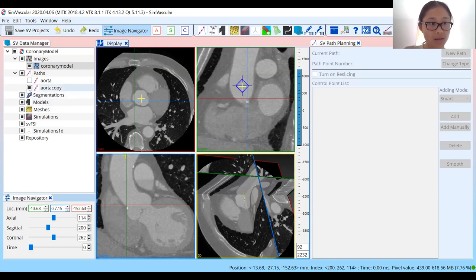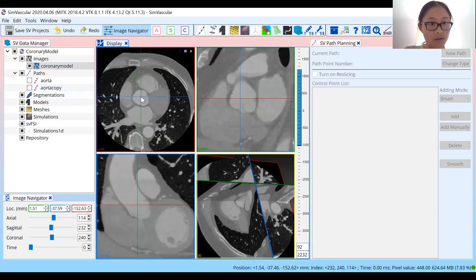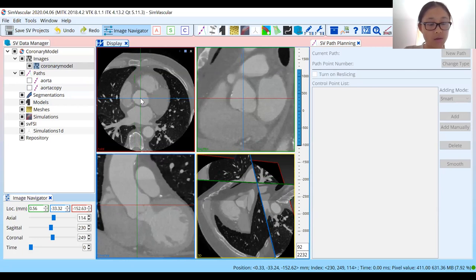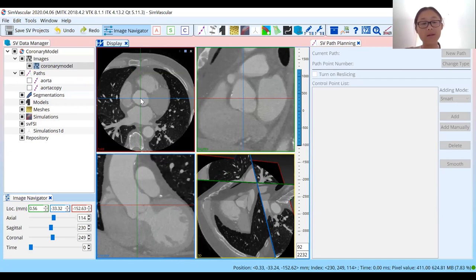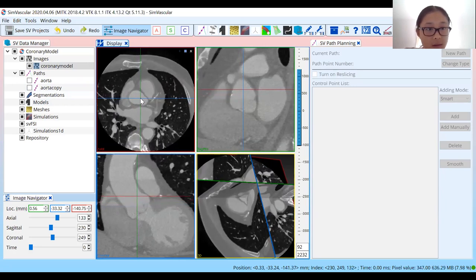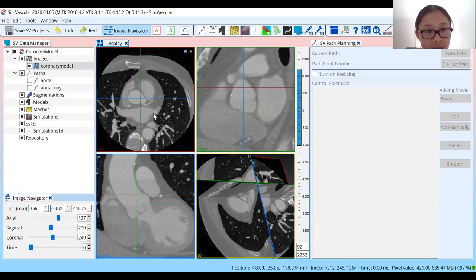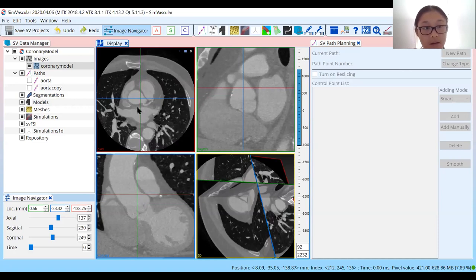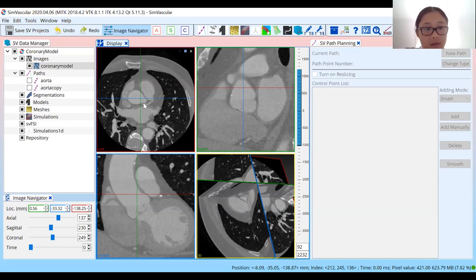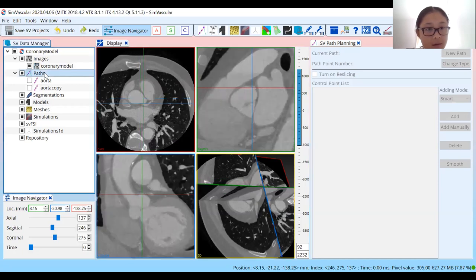To make it easier to see, I'm going to turn off that path and go back to the center. If we're looking for the point where the aorta bifurcates or where the coronary arteries start to appear, you can scroll through slowly. You'll notice that at this point you have something coming off the side of the aorta — that likely is one of the coronary arteries. Even if you don't know whether it's the left or the right right away, just so you don't forget where that point is, you can go ahead and start to create a new path.